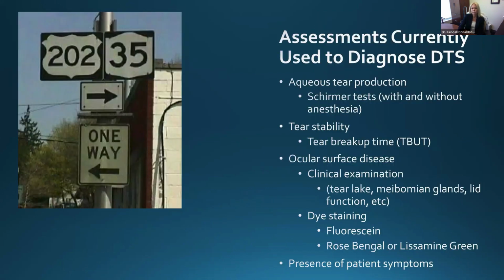We have lots of different ways to assess the ocular surface. I think, as long as you use one or two ways and you're consistent with all of your pre-op cataract patients, then that's what works for you in your clinic, but you should have some form of screening. I think questionnaires are really simple. A patient can do that in your waiting room, and that can be coupled with a Schirmer or osmolarity. In our office here, we use an OSDI, which is a questionnaire, as well as MMP9 and osmolarity. So we have three ways, and we do that for all of our pre-op patients.